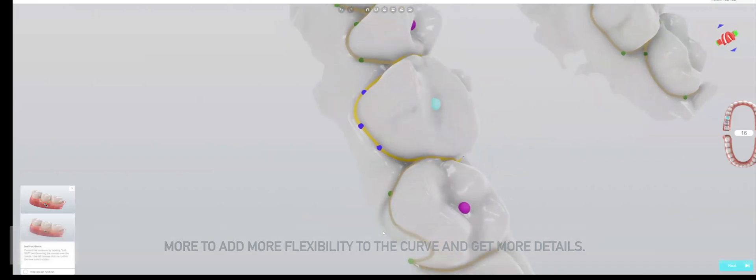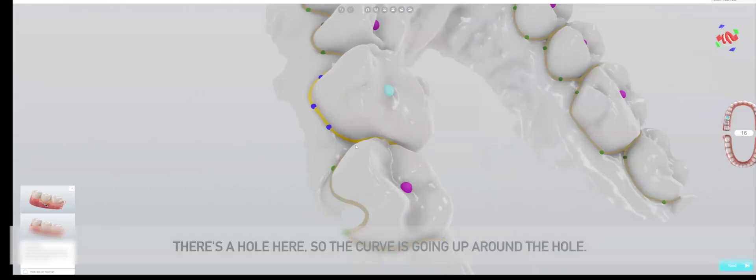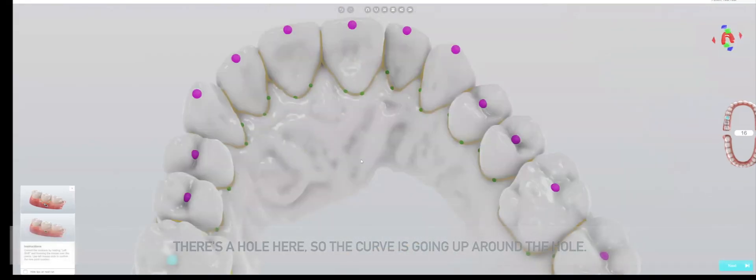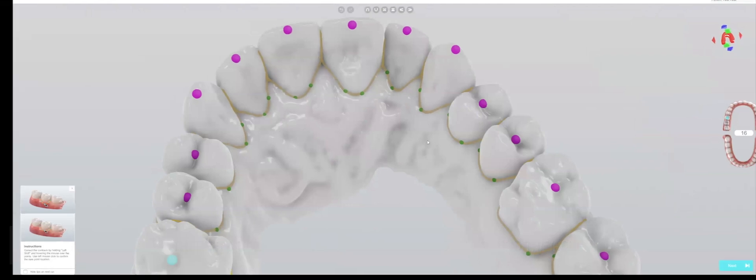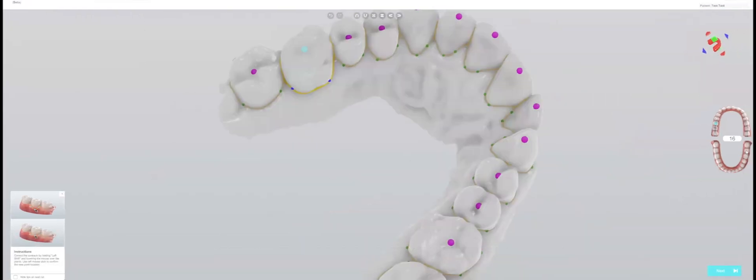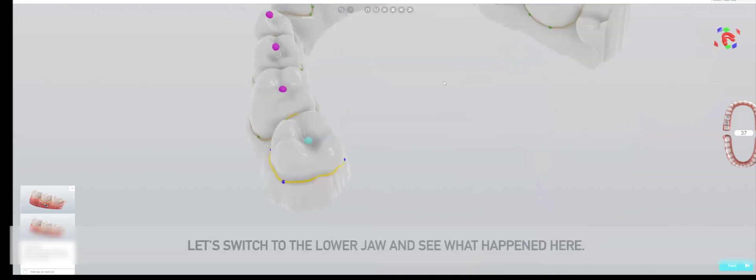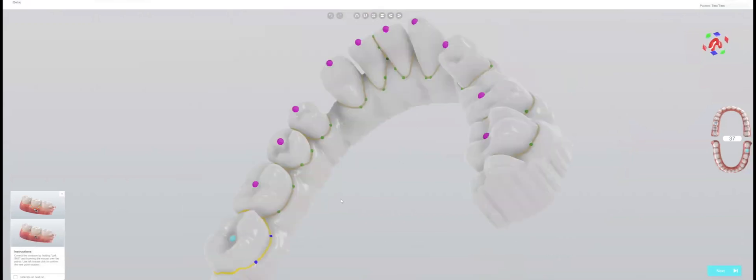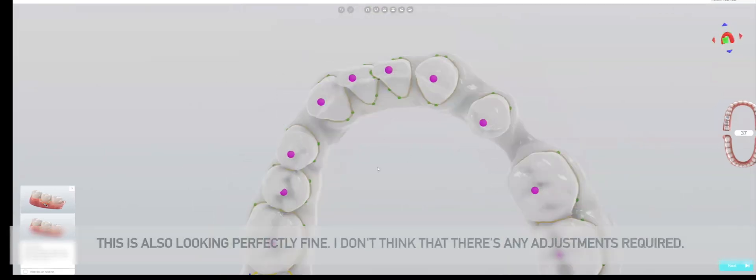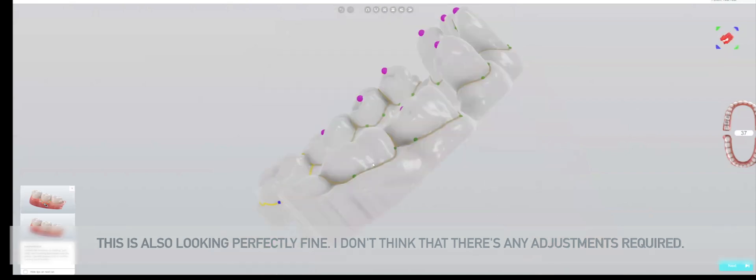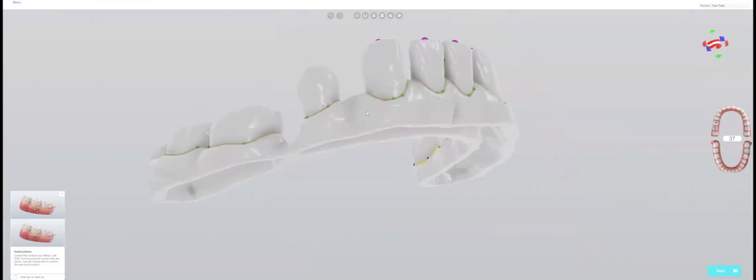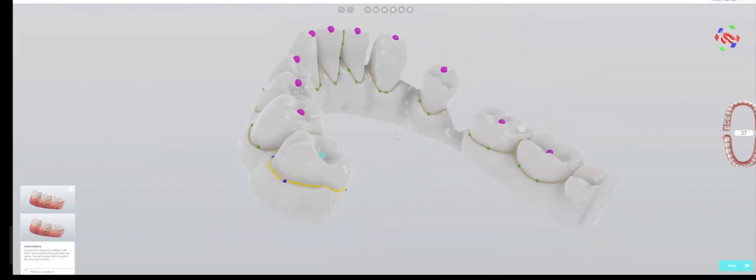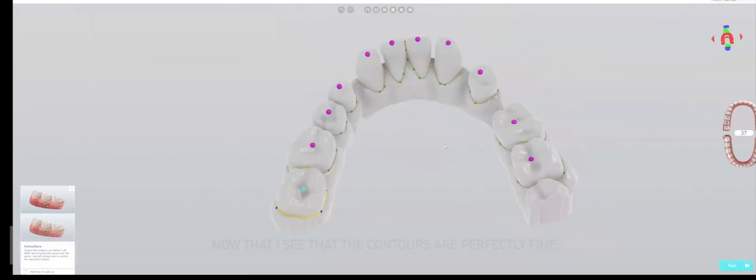There's a hole here, so the curve is going up around the hole. Otherwise this looks perfectly fine on the upper jaw. Let's switch to the lower jaw and see what happened here. This is also looking perfectly fine, I don't think any adjustments are required.